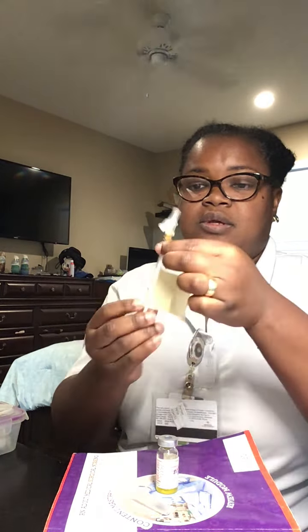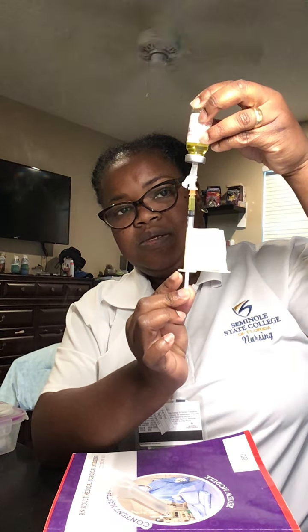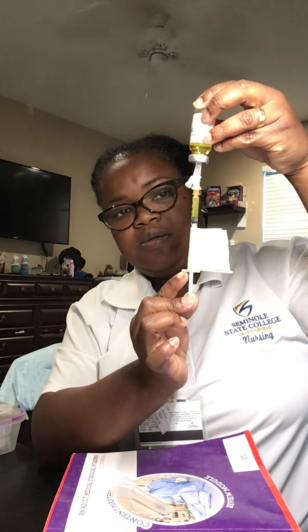Okay, insert here into the vial, air to air, switch. I just catch the liquid that I need, or the medication that I need. Okay, perfect. I catch and recap without touching.